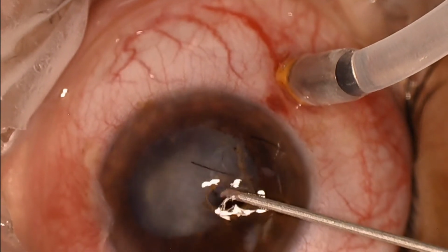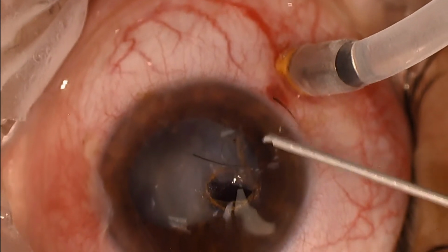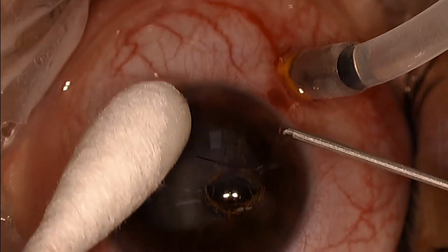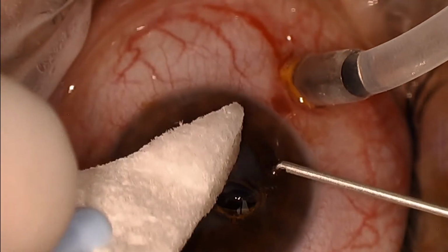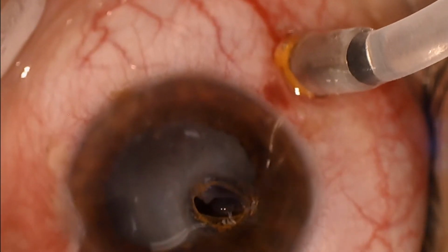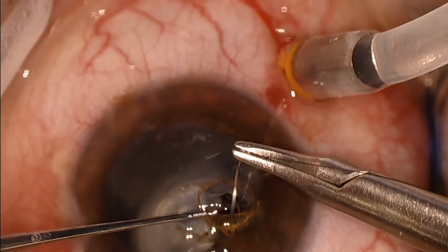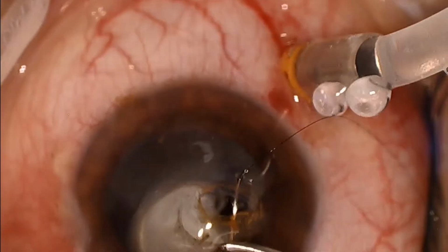How will I close this very large wound left by the nail that we've removed? First, I'm going to remove the vitreous that's being expressed from the wound. And as you can see, there's some eyelashes here as well that we need to get out of the surgical field. Also using a Weck here to get this last eyelash. And there's still quite a bit of vitreous jelly there, so I'm trying to just remove it without creating a lot of traction. Now I'm going to start closing this wound so that we can eventually do the lensectomy.